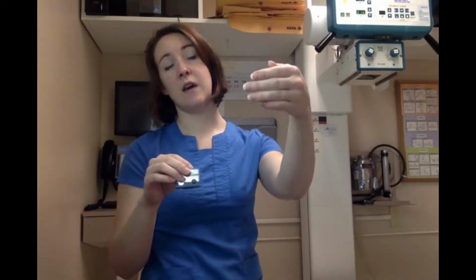And also, I want to make sure I take the dosimeter badge off whenever I'm walking around the hospital, because we don't want it to get excess radiation or millirems from anything else, such as computers or microwaves or anything that could give us false readings for our dosimeter badge. So we put it on near our thyroid shield before we take x-rays, and then when we're done taking x-rays, we put this back. We keep ours just outside of the x-ray suite in a little bin that's away from anything that could cause any radiation.